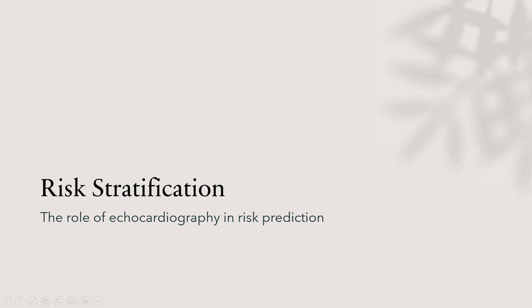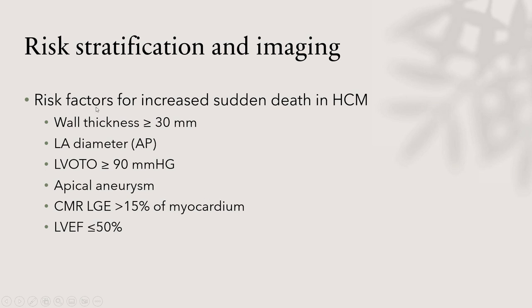On Doppler, mid-ventricular obstruction shows a CW Doppler jet peaking in mid-systole with an abrupt decrease. There may also be a paradoxical diastolic Doppler jet from the apex, possibly due to incomplete emptying, resulting in a diastolic gradient. When the apex is difficult to image — due to apical foreshortening or concern for apical aneurysm — CMR with gadolinium injection may reveal apical aneurysm or apical thrombosis.